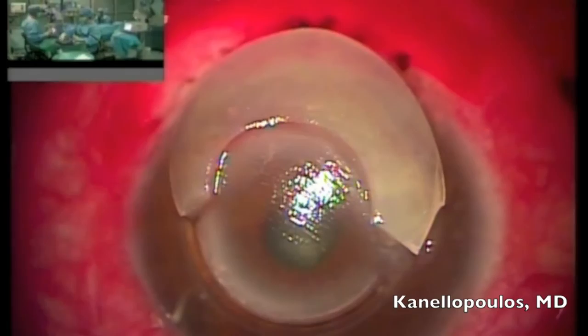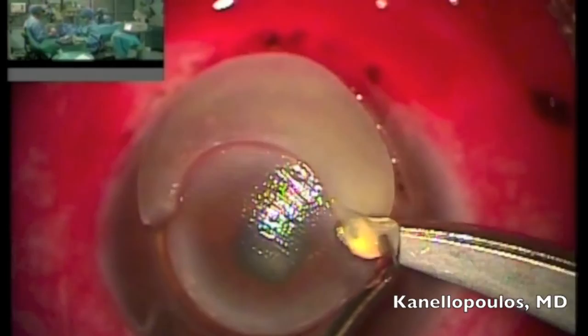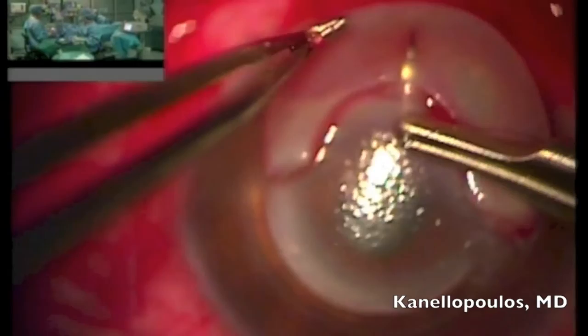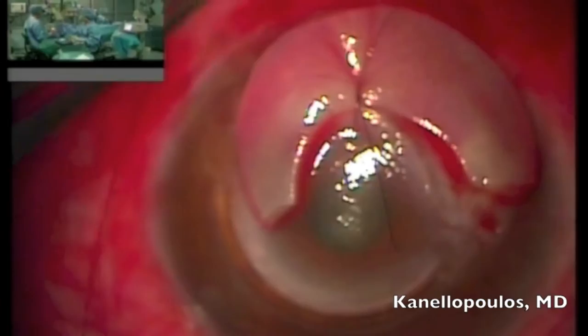We can also see the superior INTAC that's still present and the stromal deposits accumulated through the years. We're sure, of course — a few weeks after the antibiotic treatment, vancomycin and ciprofloxacin were used, fortified for the initial infection — that there's no keratitis present. We're starting to suture this patch graft.